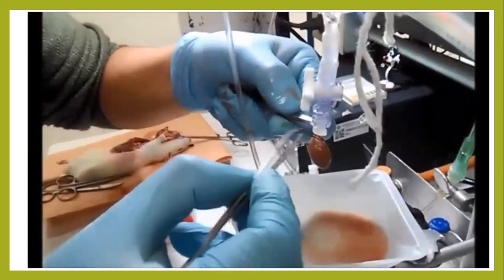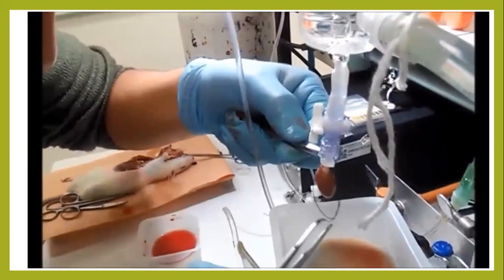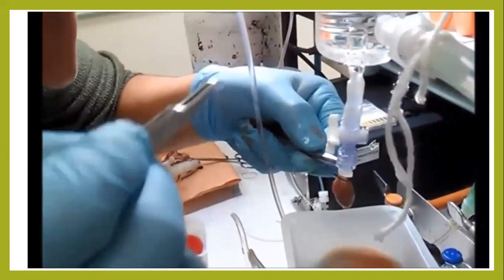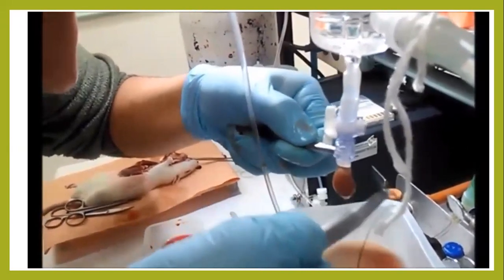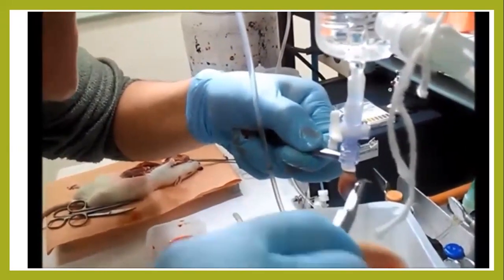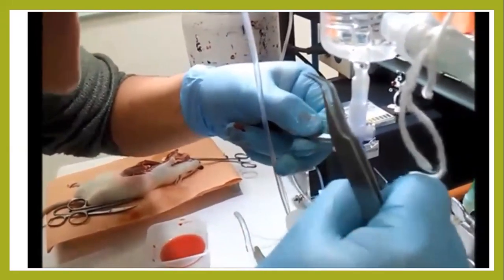See, we have attached the heart to this Symes cannula. In the Symes cannula there is PSS. Now we are tying the upper end of the heart to the Symes cannula, so it will be held in one position.